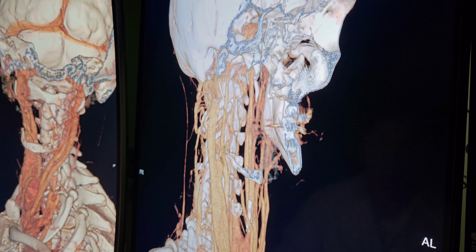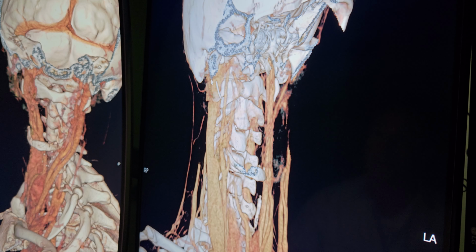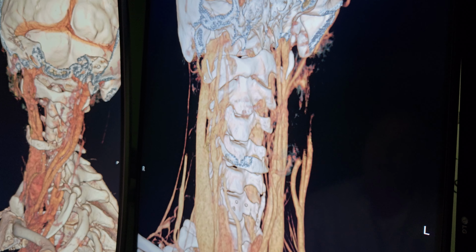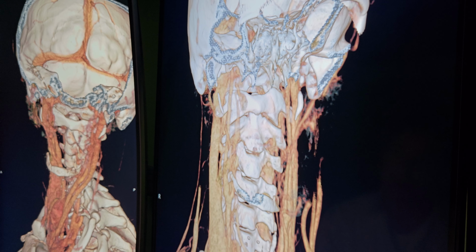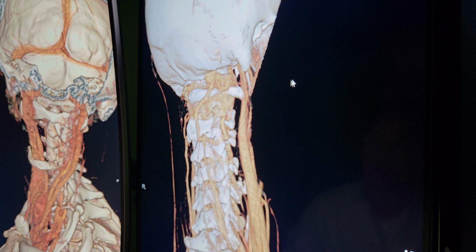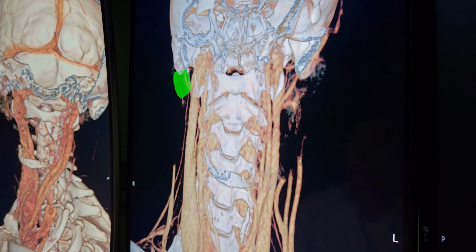So it's being pinched at the top and the bottom? It seems, yes. It seems as though we have the styloid that's calcified on the front of the jugular on the right, but the main thing is that the atlas is pushing through the jugular, so you're between a rock and a hard place. And let me give you a beautiful picture of that. So we have venous congestion.